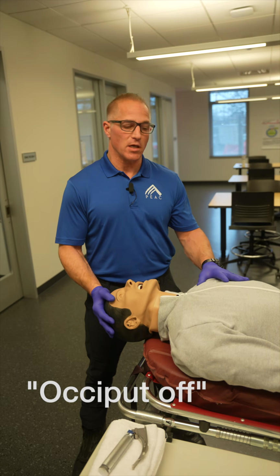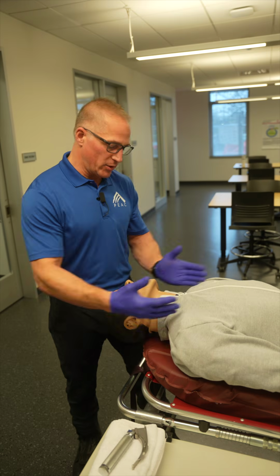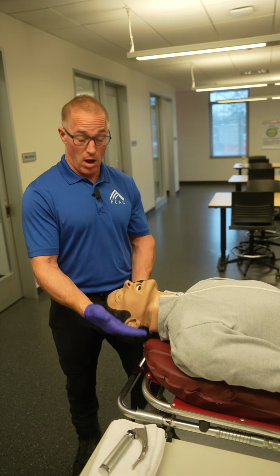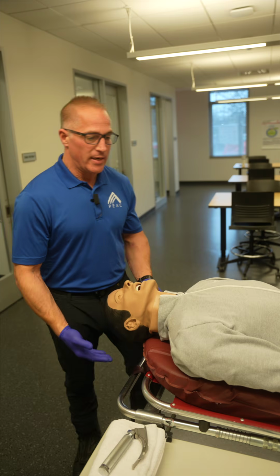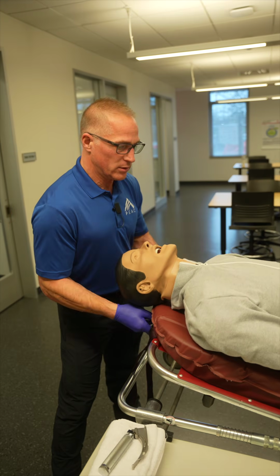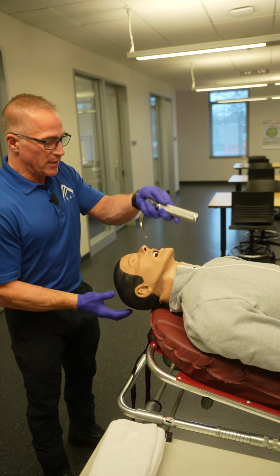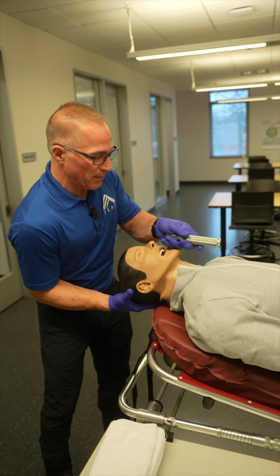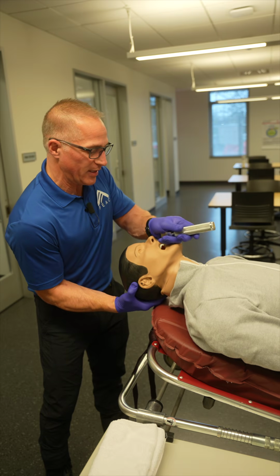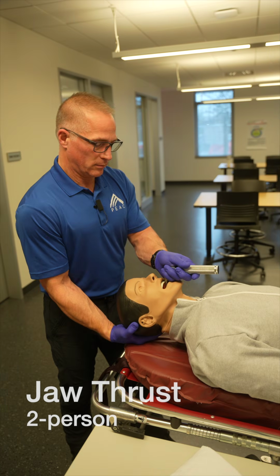Next, we're going to discuss the occiput off position. The steps involve placing the patient in the right position with the occiput off of the cot. Next, you want to lift the cot up to 25 degrees. Then in this position, as a provider, you can intubate the patient while at the same time lifting their head up into a flextension position, thus increasing your first pass success.